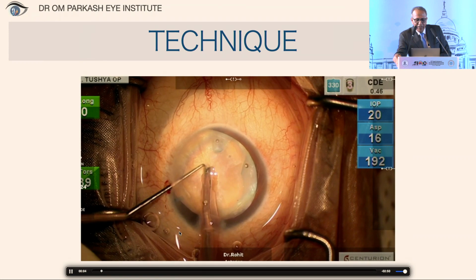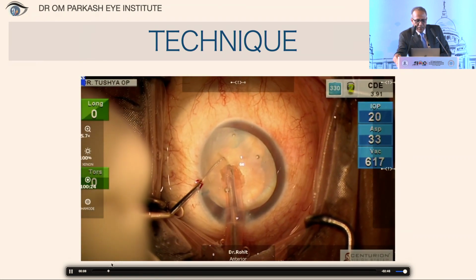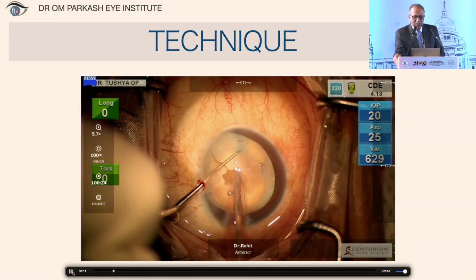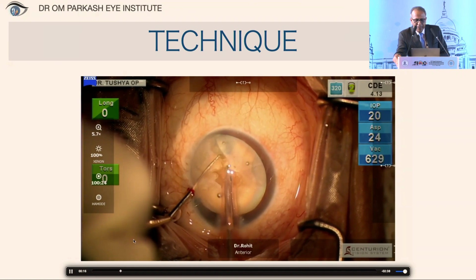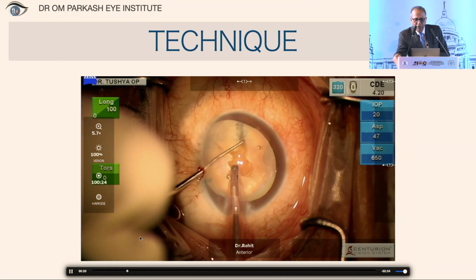And the next part is, it's a hard cataract, grade 4 cataract. Chopping is there. See the direction of separational forces. The direction of separational forces is in line, in the axis of the rhexis tear. So that is another very important factor. So this part is now continuing. Again chopping it, separating it, flap fluttering, reconfirming that it is a pre-equatorial one.